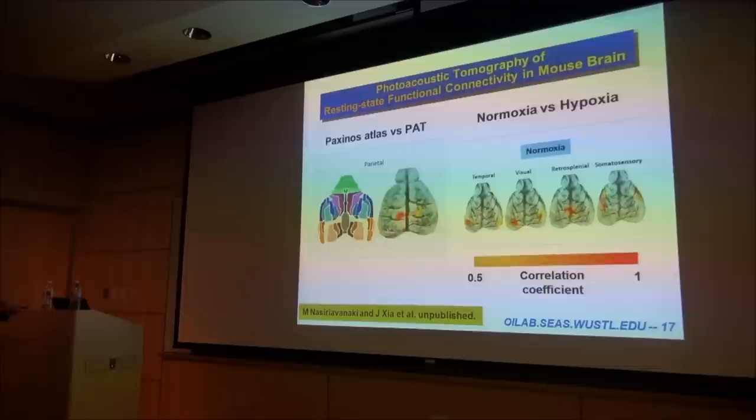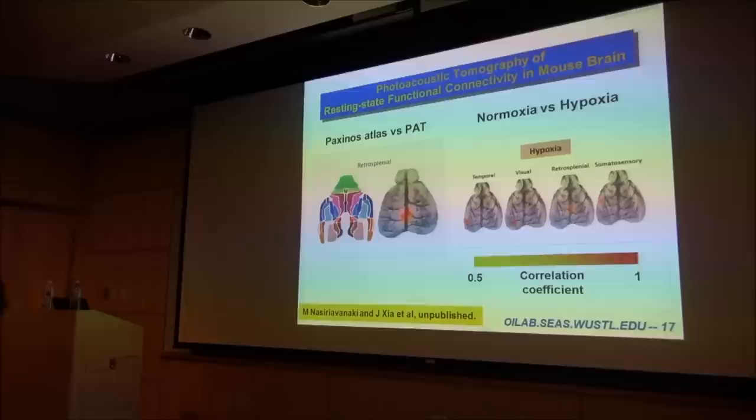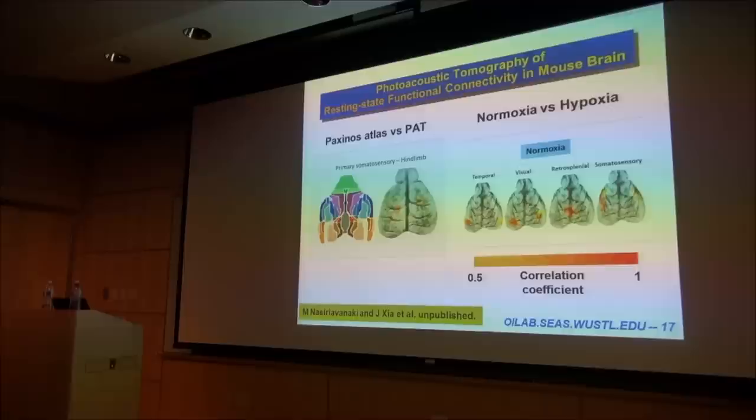You can go through all of them. At the same time, we call ourselves stressed animal, but still looking at the resting state between normoxia and hypoxia. In normoxia, you can see the correlation, very strong correlation, but under hypoxia, the correlation stops. So it's a very striking difference.